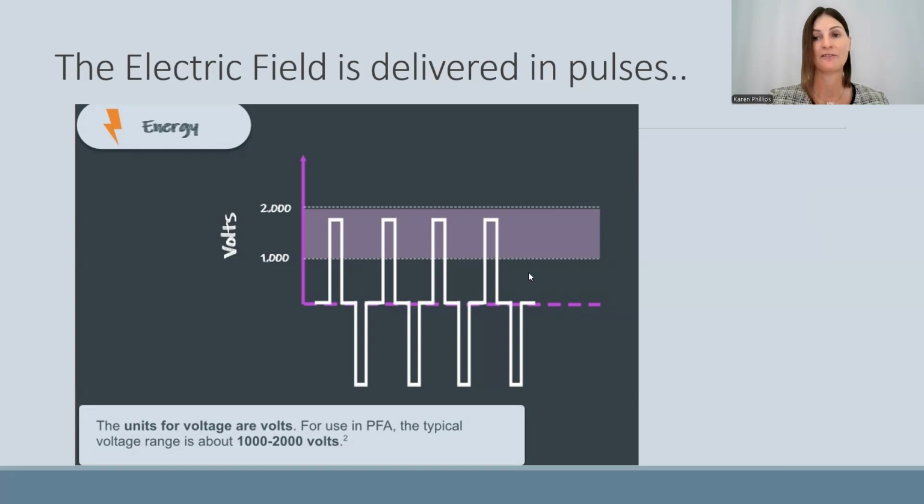And if you're really interested in the biophysics of pulsed field ablation, electroporation, the strength of this electric field is basically in the region of 2,000 volts. If you remember that, mains power, when you plug in to a socket in the wall, that's 240 volts. So basically these are micro treatments in a very small area of the heart, but they're 2,000 volts of electric field that's being applied.